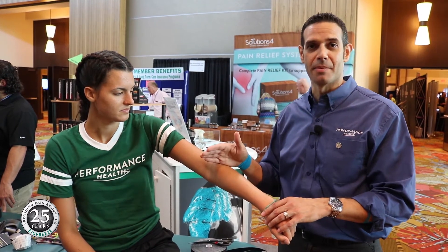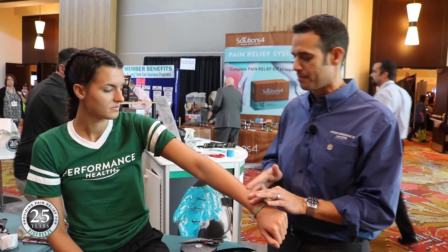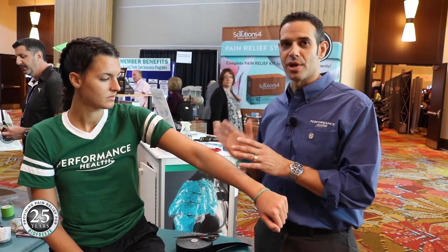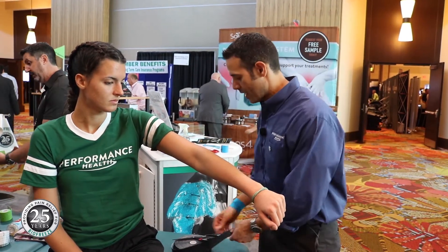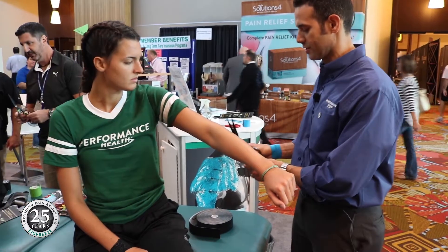Right away, that's telling me that our tape job is going to be going in this direction. Classically, what you've seen in kinesiology taping for a tennis elbow, you're just going to basically take a strip of tape, go through the extensor forearm and cover the epicondyle. The most important thing is actually creating some kind of a neural plane that's going to improve the strength and decrease the nociception of the injury. In her case, it's going directly across perpendicular to the tendon.